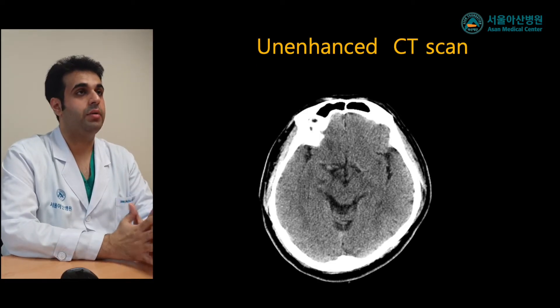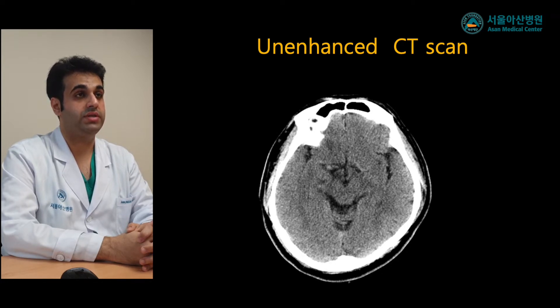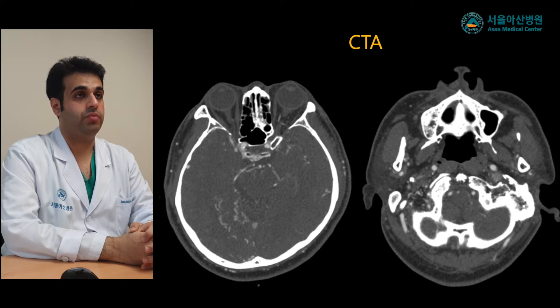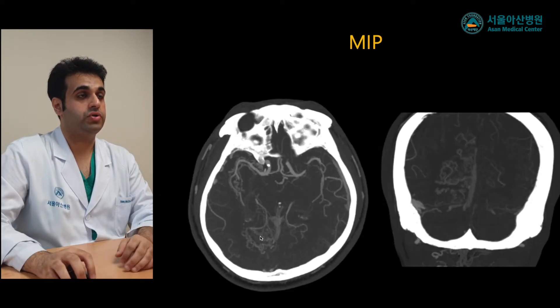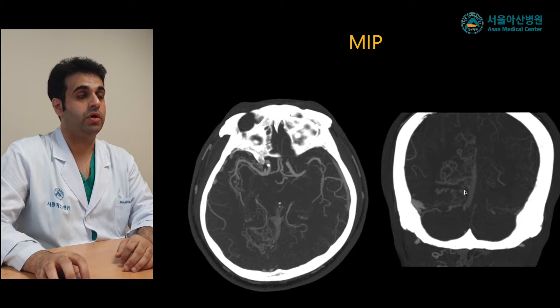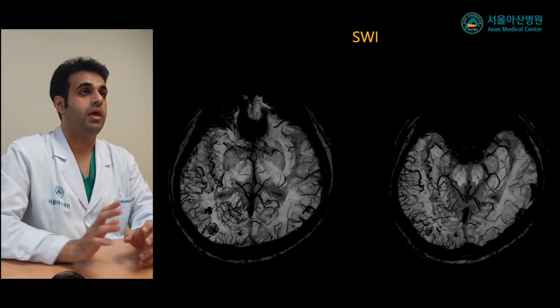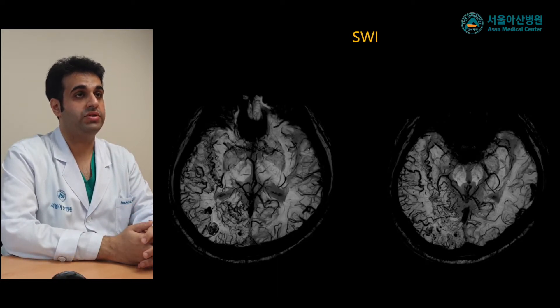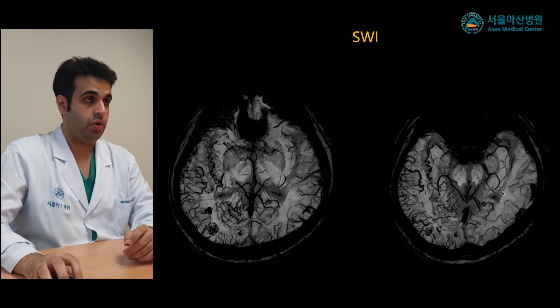We started with an unenhanced scan of the brain, and there was no abnormality seen. CT angiogram was performed and demonstrated multiple dilated vascular tortuosity at the right occipital and anterior temporal lobe. Some of these vessels are attached to the torcular and the posterior and superior sagittal sinuses. On susceptibility-weighted imaging, there is increased venous congestion at the right occipital-temporal region with multifocal blooming artifact at the right parieto-occipital region.